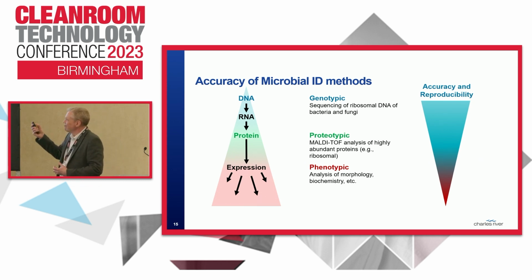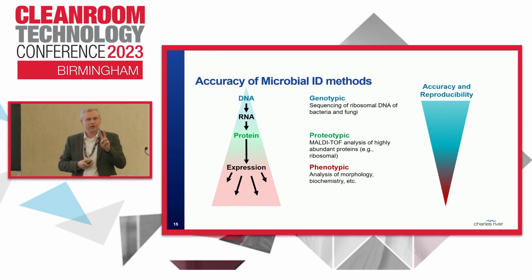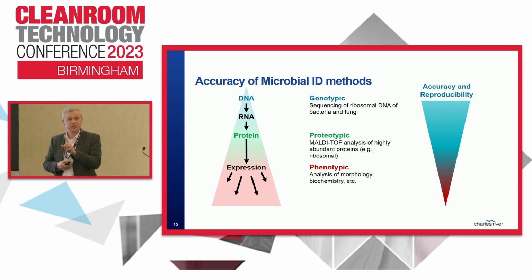But it's not just the gram stain that's the issue here. We saw in the case study there was 2 wrong isolates. One we identified as a gram-negative, which their system got wrong. The other one we identified was a gram-positive. Their system still got it wrong, but it was a gram-positive, which means they did the gram stain correctly, but it still gave the wrong result. So we can't just say, oh, this is an issue with the gram stain.